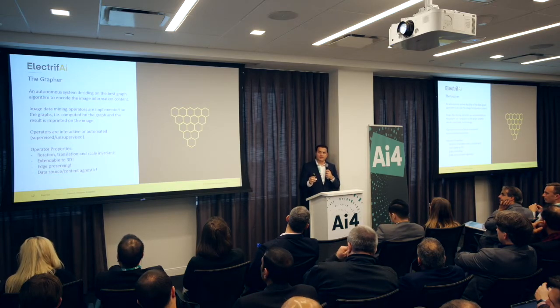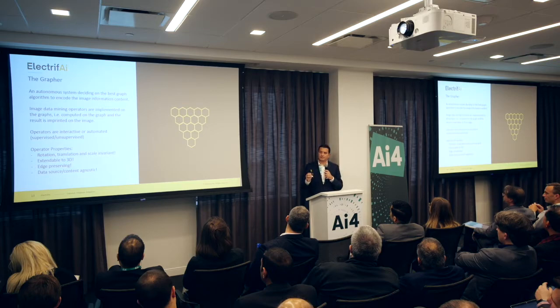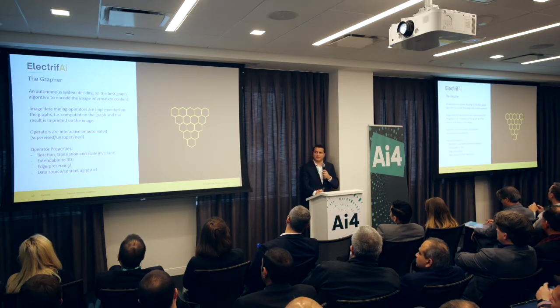And the other thing is, things appear very differently from close by or from far away. So the scale invariance is also particularly important. And one last one is the translation. So where is this object with respect to the x, y coordinates? We need to have the operators extending to 3D without any problem.